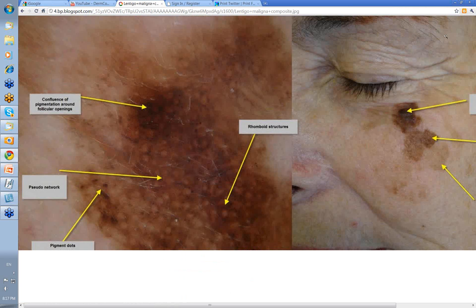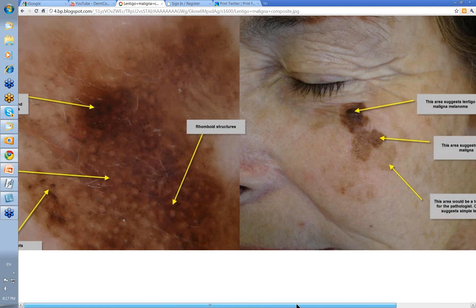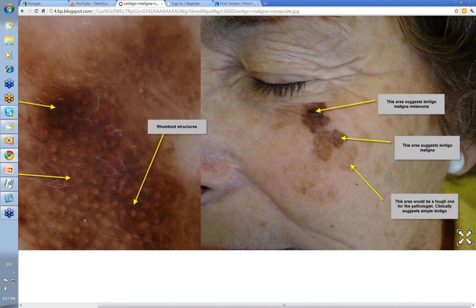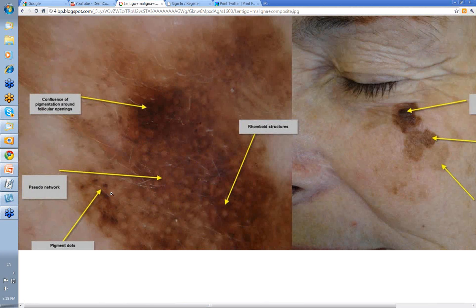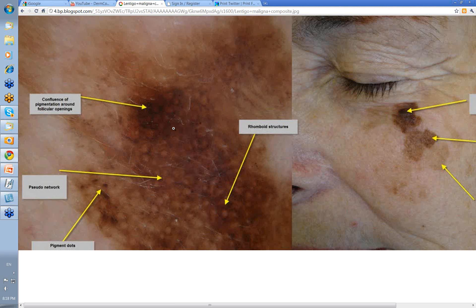This is an interesting one as well — it shows a variety of features. That's the clinical lesion; it's a big lesion. If you put your dermatoscope on one area, it may show features of a solar lentigo. In the area with varying pigmentation, you may see early perifollicular accentuation of pigment consistent with lentigo maligna. The darker, slightly raised area suggests a lentigo maligna melanoma — an invasive component. You'll see rhomboid structures here, where pigment fills in the perifollicular space creating a rhomboidal structure. Here you've almost got obliteration of the perifollicular space, suggesting a thicker or more extensive area of lentigo maligna, perhaps lentigo maligna melanoma.